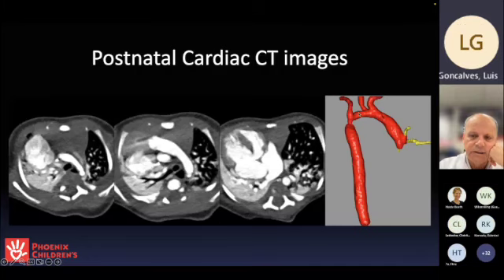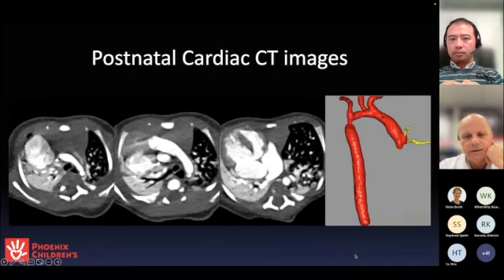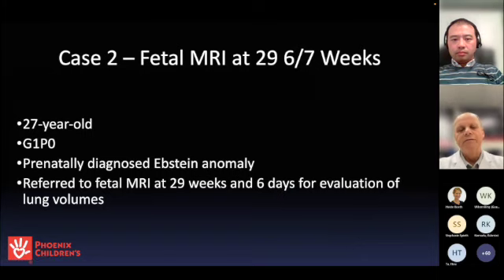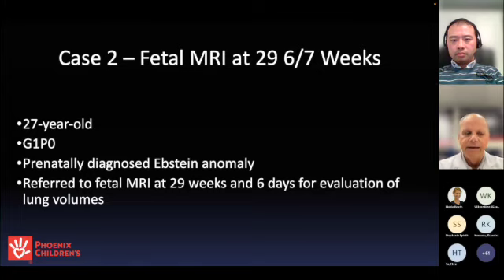Transverse arch compared to the patent ductus arteriosus here, the VSD, and the reconstructed 3D view of the aortic arch. Just to finalize, I want to make a point about whenever you are imaging the heart, you have to also make sure that you image other parts of the baby, because there may be something else going on that you don't appreciate. And the same is true if you image brain or body, you should also look at the heart.